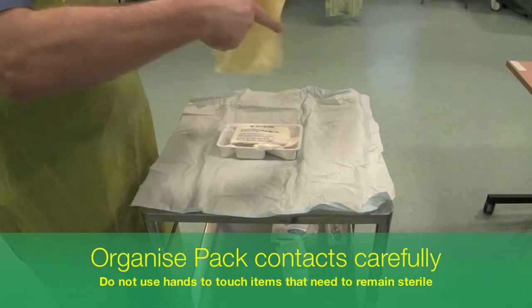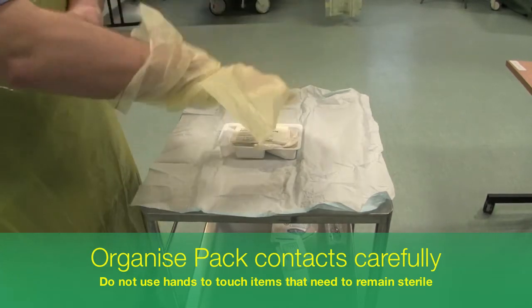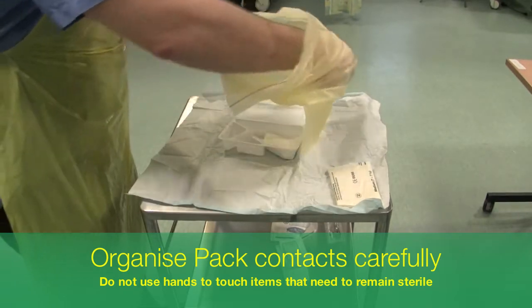Using the yellow bag that comes packed inside the pack, carefully distribute the contents of the pack around the field so that you can touch one thing without accidentally contaminating others.